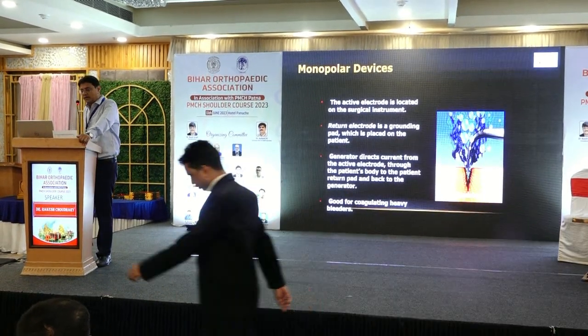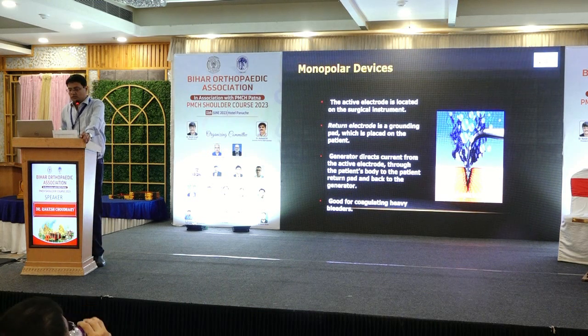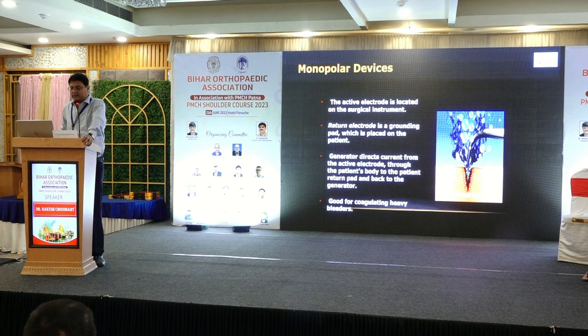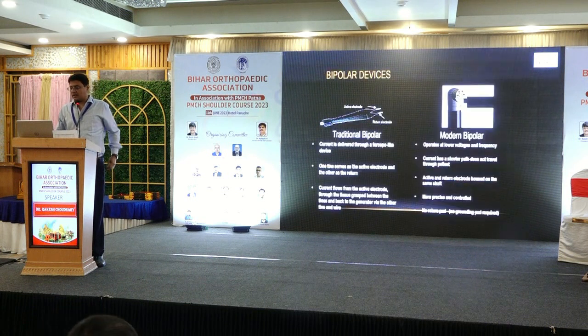Then comes the monopolar device. The active electrode is located on the surgical instrument. The return electrode is the grounding pad, which we all know is under the patient somewhere. The generator directs the current from the active electrode through the patient's body and to the returning generator.